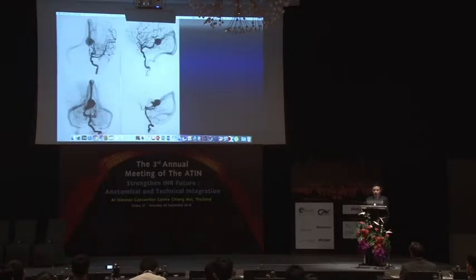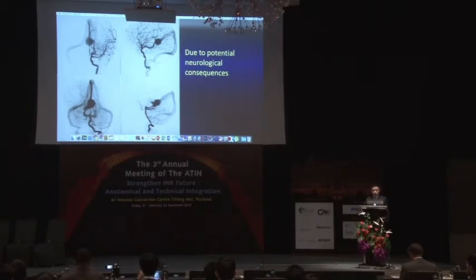So the angiogram looks like this. I think it's an incidental finding. You need to decide whether to treat it or not. But we decided to treat this patient because the disease has potential to develop a neurological deficit.